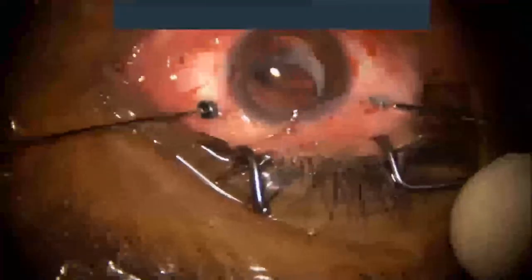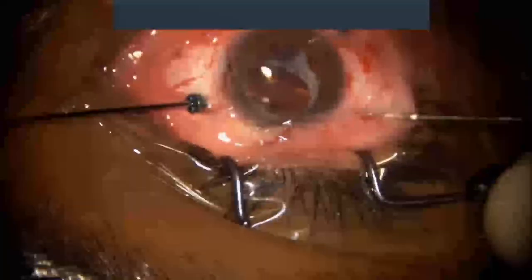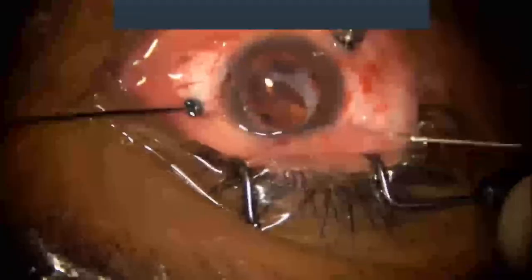What we see is that it does not look like a normal intraocular lens looking at the design. Maybe an iris claw lens? Let's find out. An intraocular forceps was used to grasp the lens. It kept escaping the grip, but the endoilluminator probe helped in directing the lens and getting it towards the forceps. There we go. The lens was held with the intraocular forceps and brought up into the AC using the shake hand technique.